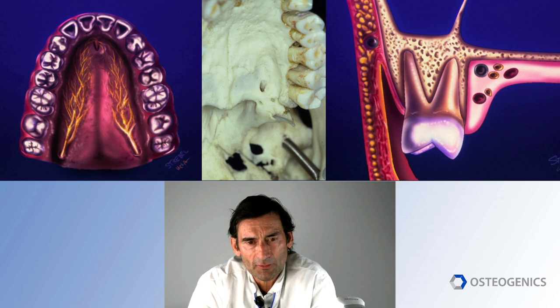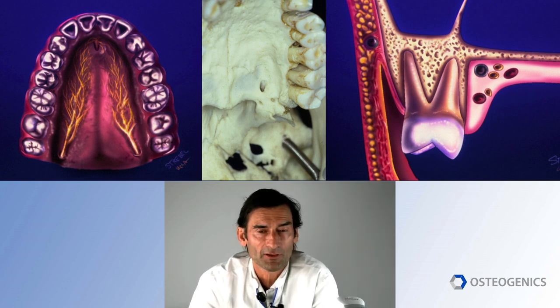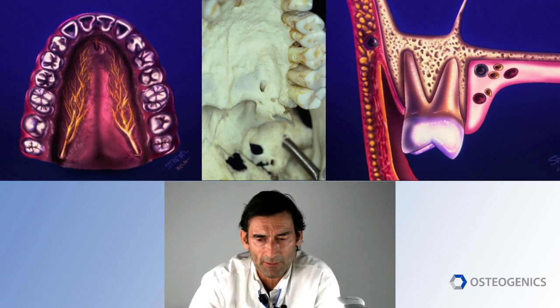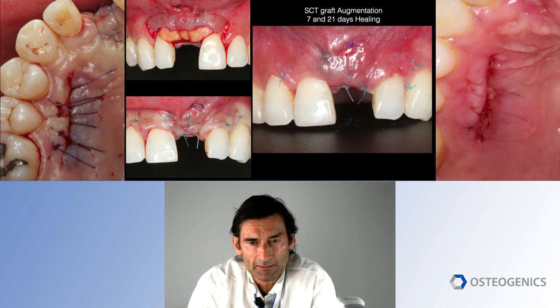But, you know, often when you take a subepithelial connective tissue graft from here, you have a lot of bleeding. And so, of course, clinicians are concerned about this. Patients get really nervous about this. And it's one of the worst things that can happen when patients leave your office really anxious and concerned about this. So I have this suture technique, which gives you almost perfect control of any bleeding.